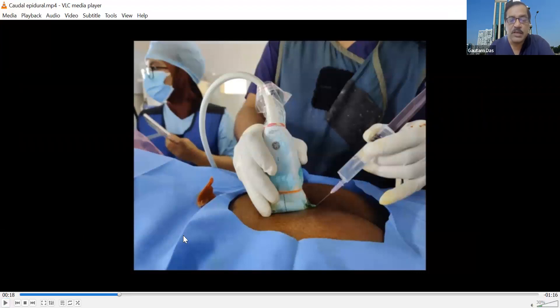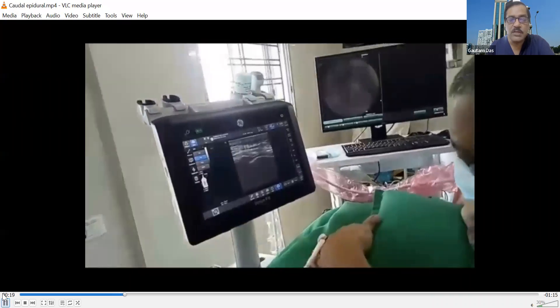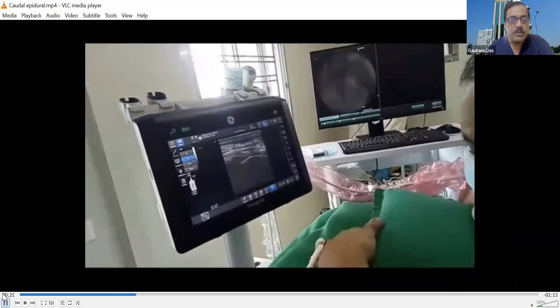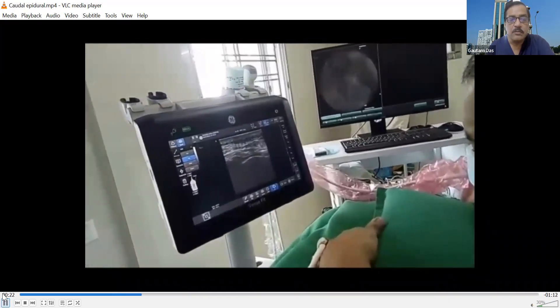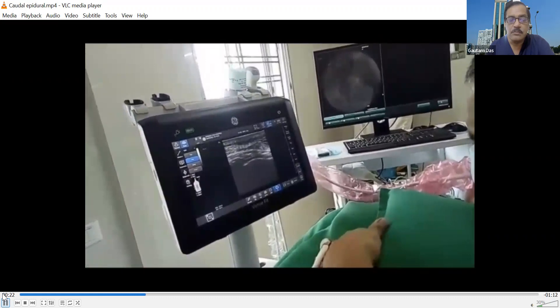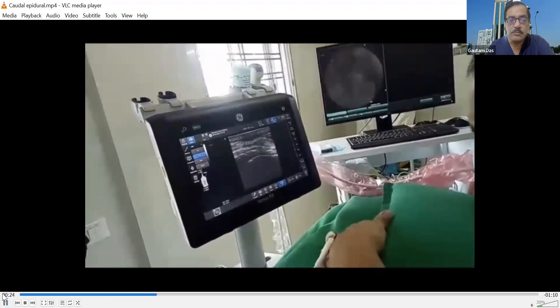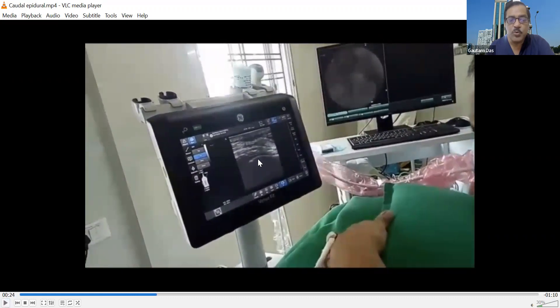The probe is held again in the long axis, and local anesthetic infiltration is done. We can see the sacrococcygeal ligament, the sacral vertebral body, and the midline sacral crest.